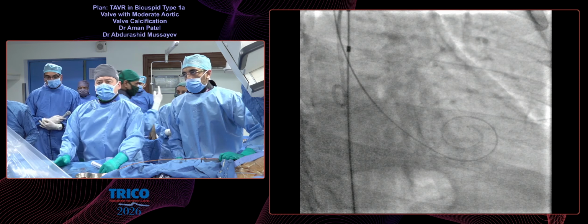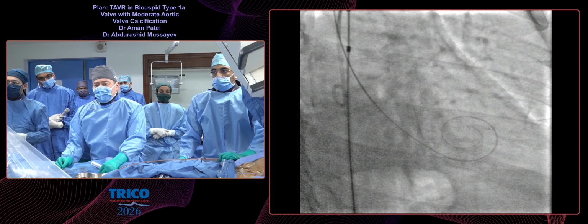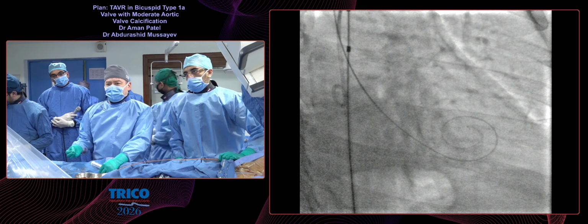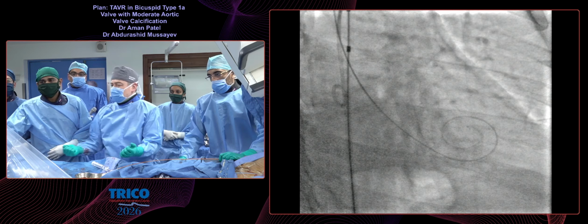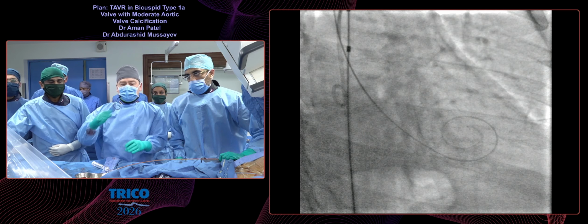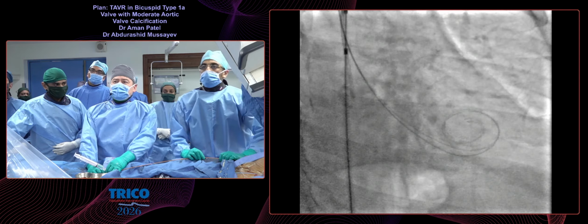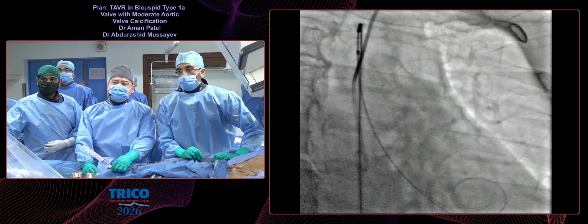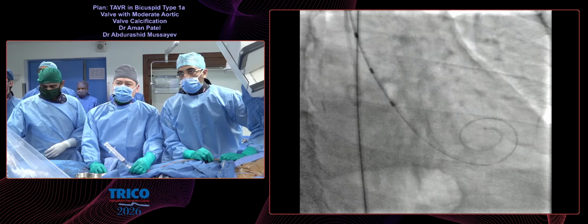Some operators think this is maybe a little bit of a disadvantage, but in my opinion this flexibility is an advantage of this valve because you could manage coaxiality with the wire, you could fix the wire and delivery system, and it is very easily crossed through the aortic arch. Another advantage is the intermediate sizing. So in typical bicuspid valves, we can prevent over and under sizing.